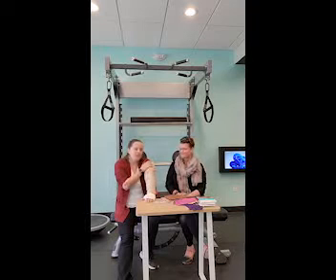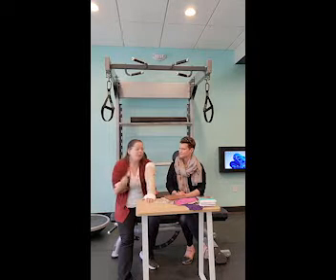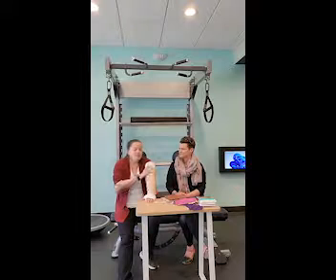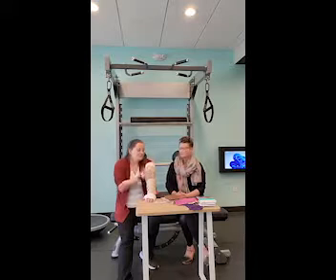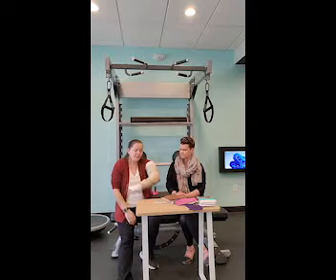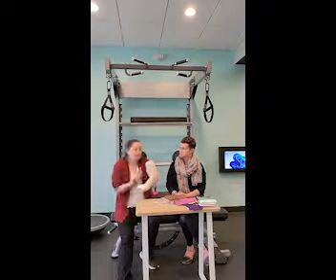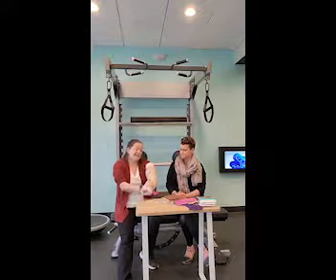So there's a great variety out there if a sleeve is not the right option for you. I had one gentleman who was still going through radiation because he had a very aggressive cancer, and they needed to be able to get to his arm for wound care, all of that. Pulling that sleeve on and off was irritating the skin, so we went with something like this. Again, if someone has tone from a stroke, this can go on very easily, and you can help them. You could get a sleeve on them depending on what's going on, but this is a nice option.